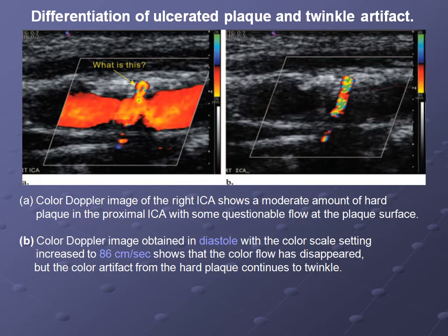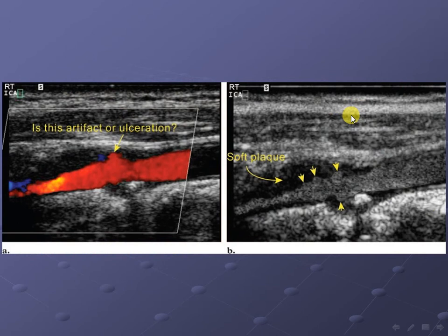In the gallbladder, also on the kidney. Sometimes in the kidney, if there is pregnancy, to avoid the exactly. This is a twinkle artifact. It's just an artifact from cholesterol deposits. When you put color Doppler, it will give you this artifact. Excellent.